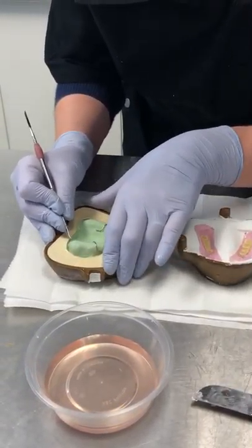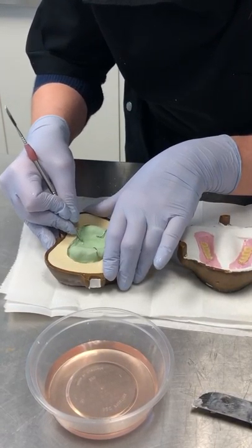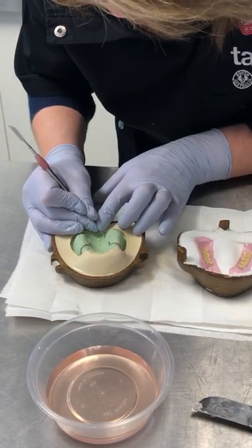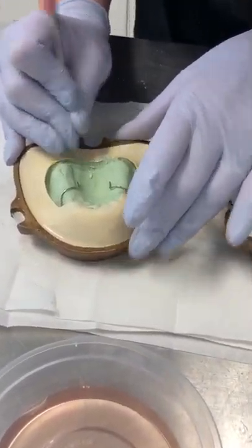If you haven't carved your post-dam and your master model, then be conscious to make sure that you do it now. Not too deep.